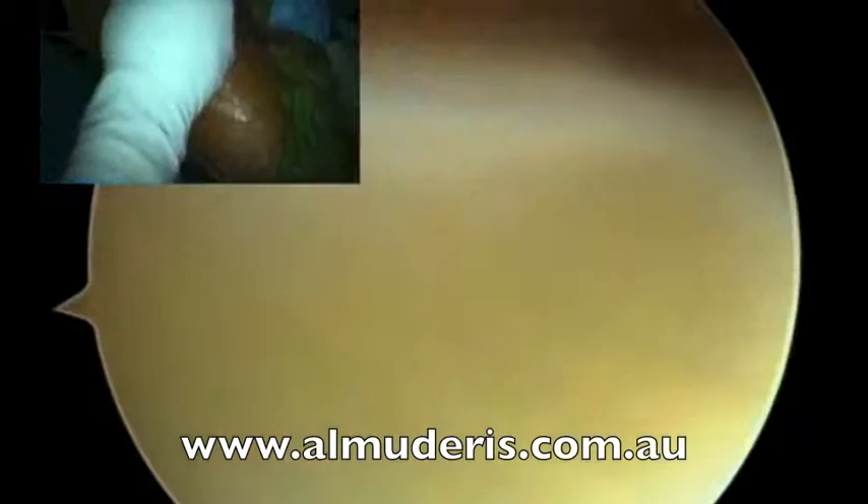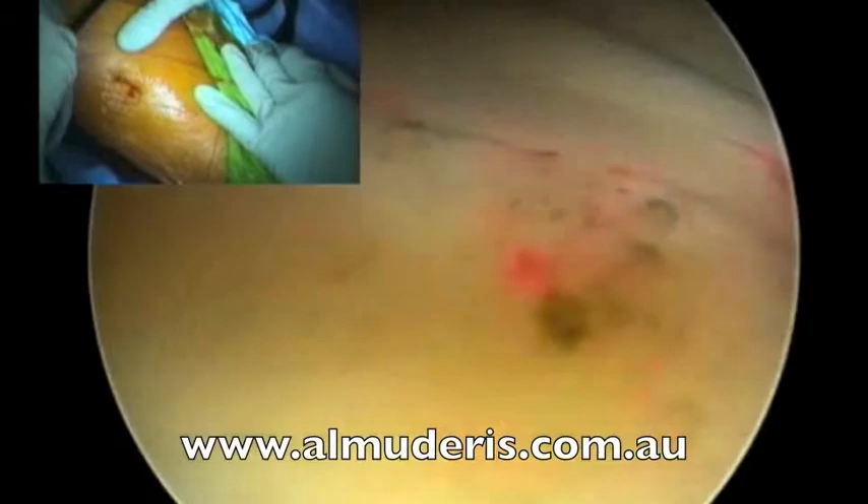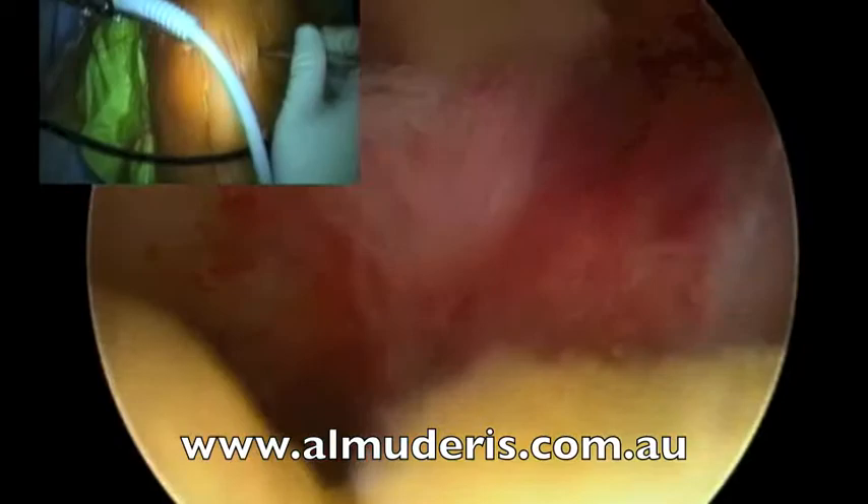Then we move to the lateral compartment using the figure of 4. Push some fluid please. The lateral meniscus is clear as well. Back to working position.